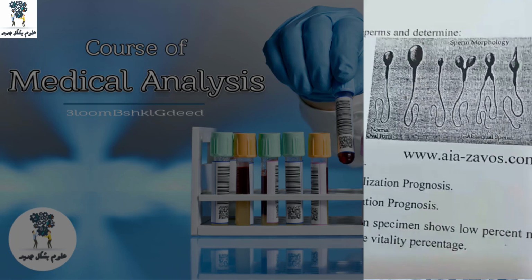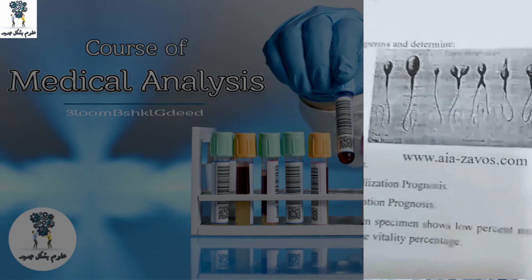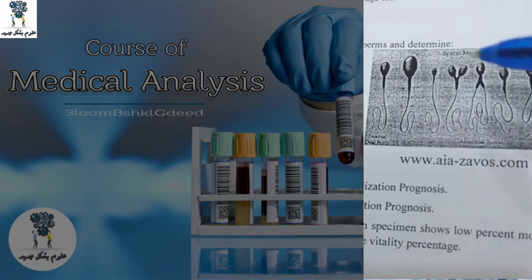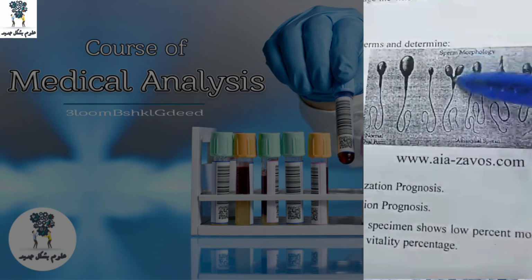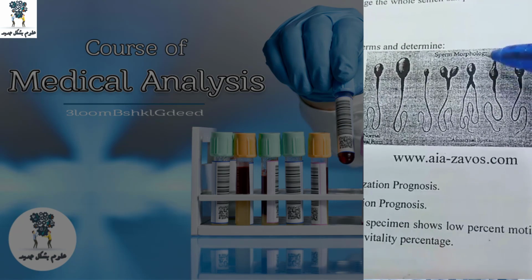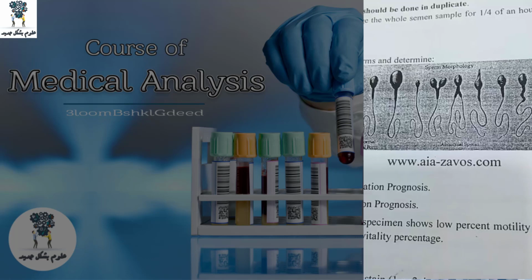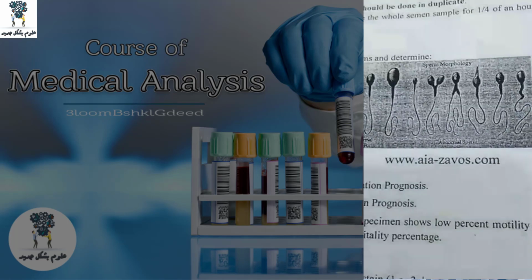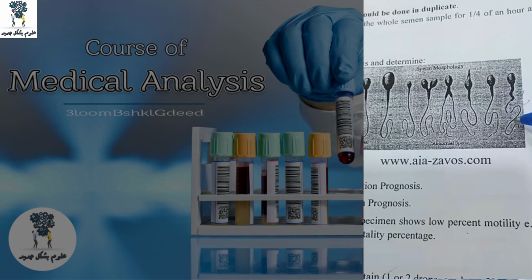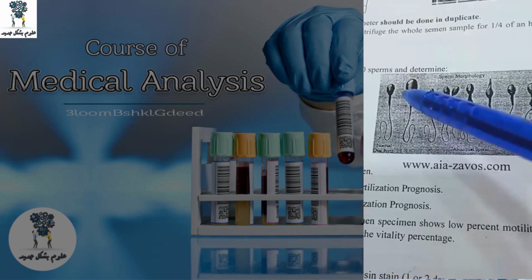There are different abnormalities that we can see under the microscope. For example, multiple heads. It is not normal for a sperm to have multiple heads, or 2 tails, or an abnormal head shape. It is not normal to have a very long tail or a short tail, or a cut tail, or no neck. It is also not normal to have a small head or a big head.